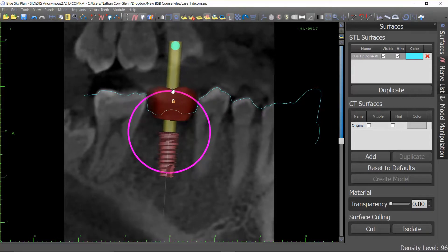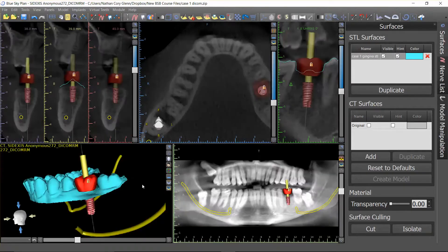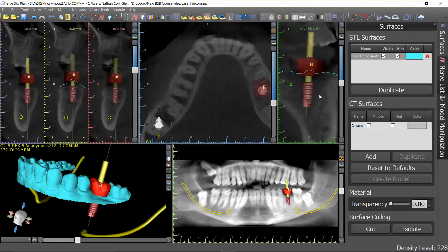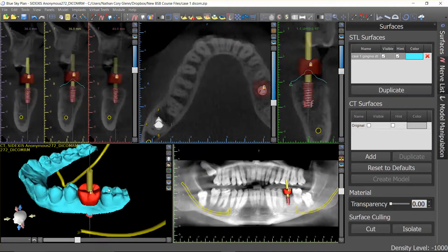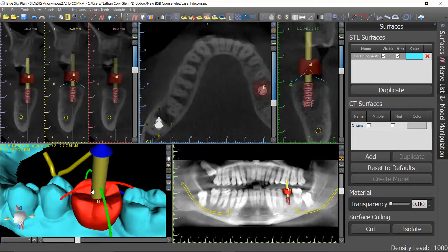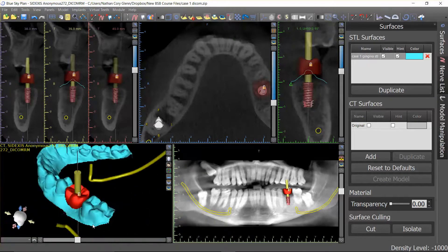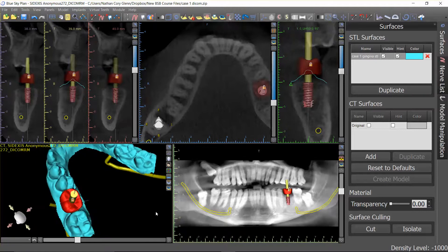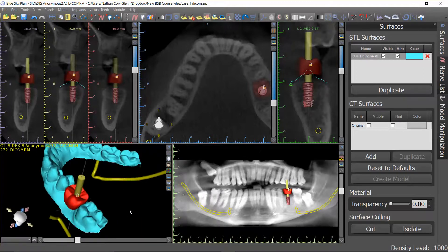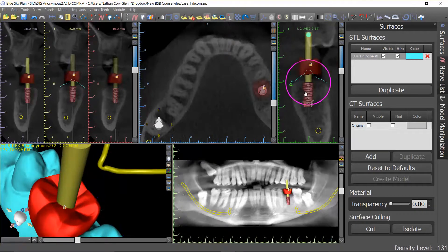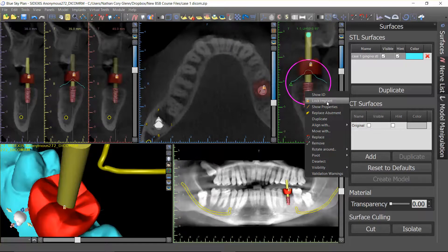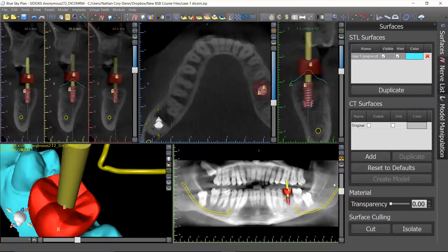Paralleling the adjacent tooth roots, pulling over just a little bit, I can see I'm coming right through the buccal groove with the emergence. Very quickly I'm able to position it into an ideal spot — making sure I have my zone of safety from the nerve, not impinging on any of the buccal or lingual walls, and about a millimeter subcrestal. To me this is an ideal placement. The abutment gives me a good indication of where the implant would emerge if done as a screw-retained restoration — and that looks very good. Once you've done that, lock it: right-click, lock implant. Now you are ready to make the guide.